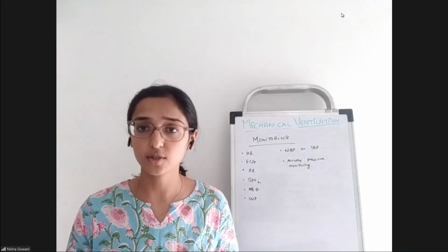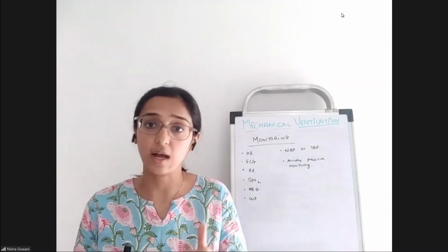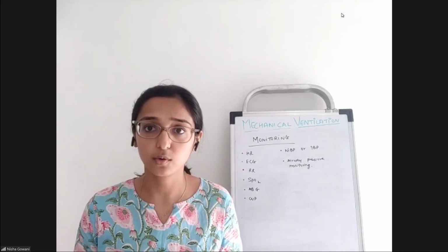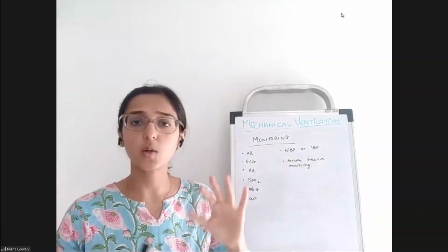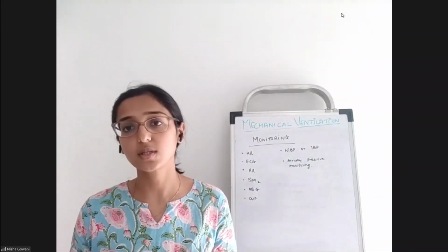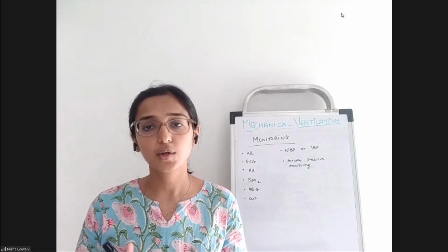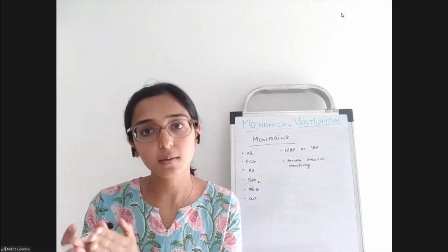All right. The airway pressures have to be monitored whether very high pressures are going to the patient or not, because if very high pressures are being delivered, it can cause barotrauma. Monitoring that has to be done, which is the NIBP or the IBP. So NIBP is a non-invasive BP, which is through the cuff. IBP is the invasive BP monitoring, which is done when the patient is on some kind of inotropic support, so that you get the beat to beat BP reading.